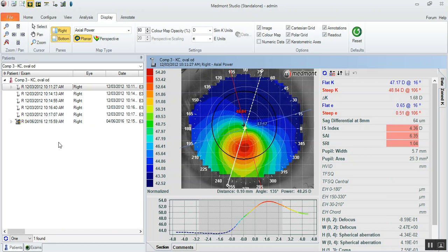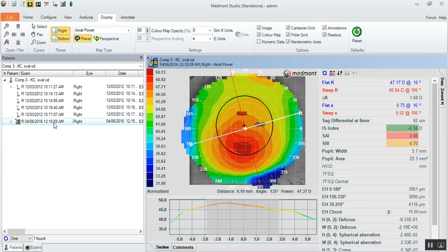The Composite Map will fill in all that space out here by allowing us to capture all the data points as far out on the cornea as we possibly can. So in this case, we took a second capture, the Composite Map, and now we've filled in this peripheral cornea, and we can best predict the initial sag that we need.